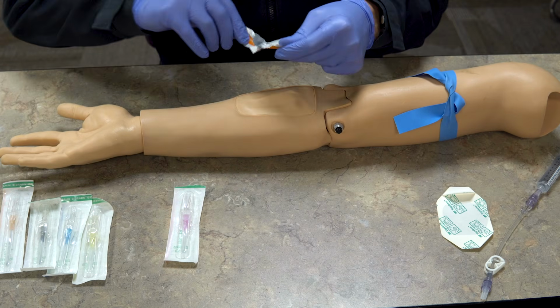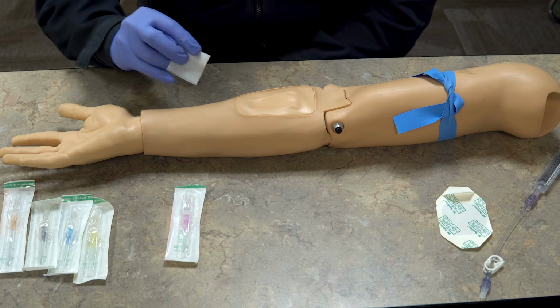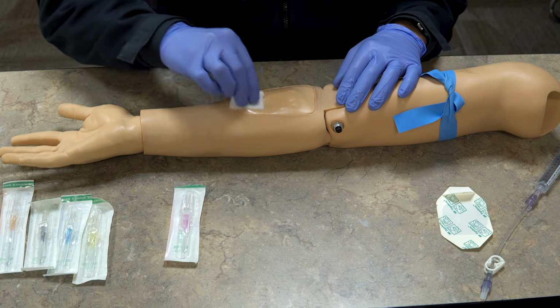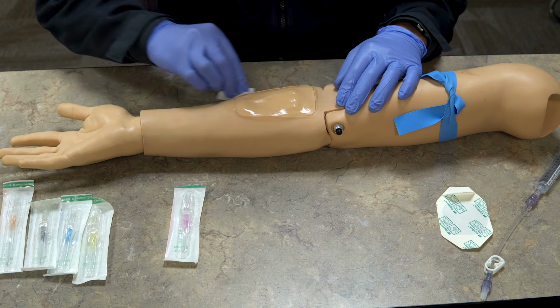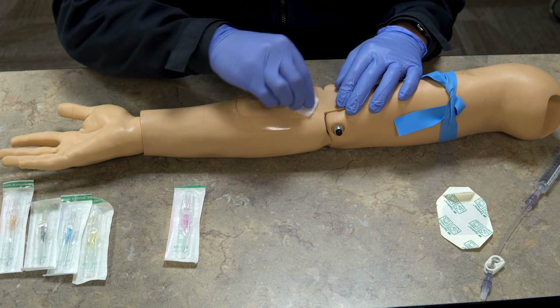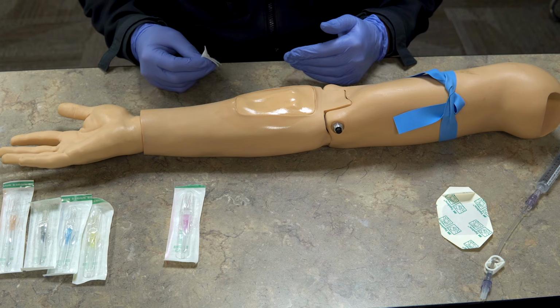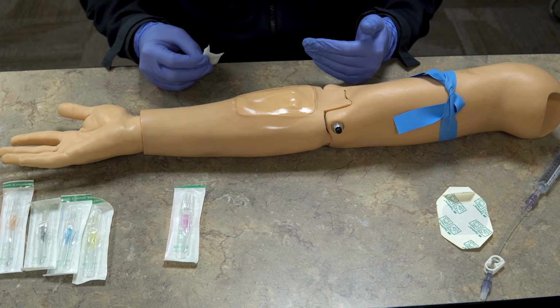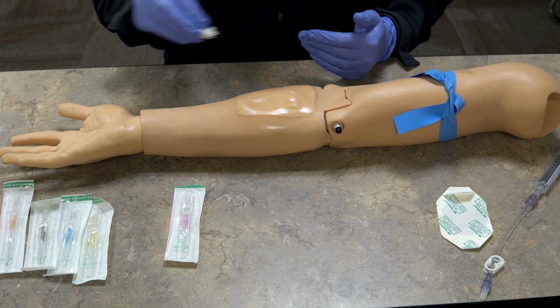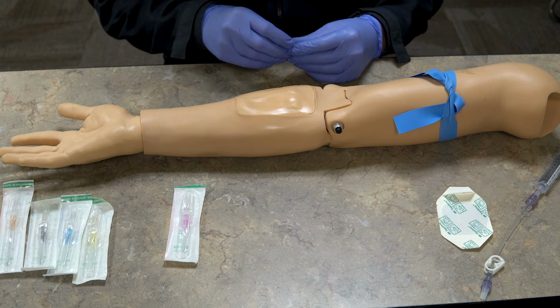I'm gonna take my alcohol pad, ChloraPrep, whatever you use to sterilize the wound or the site. I'm gonna take that, I'm gonna find the site, and you wanna sterilize in a circular pattern working outwards. So you work outwards, and you're supposed to do this for 30 seconds. You know, I'm not saying that's the wrong thing to do, but a lot of times we do not spend 30 seconds doing that just for time's sake.